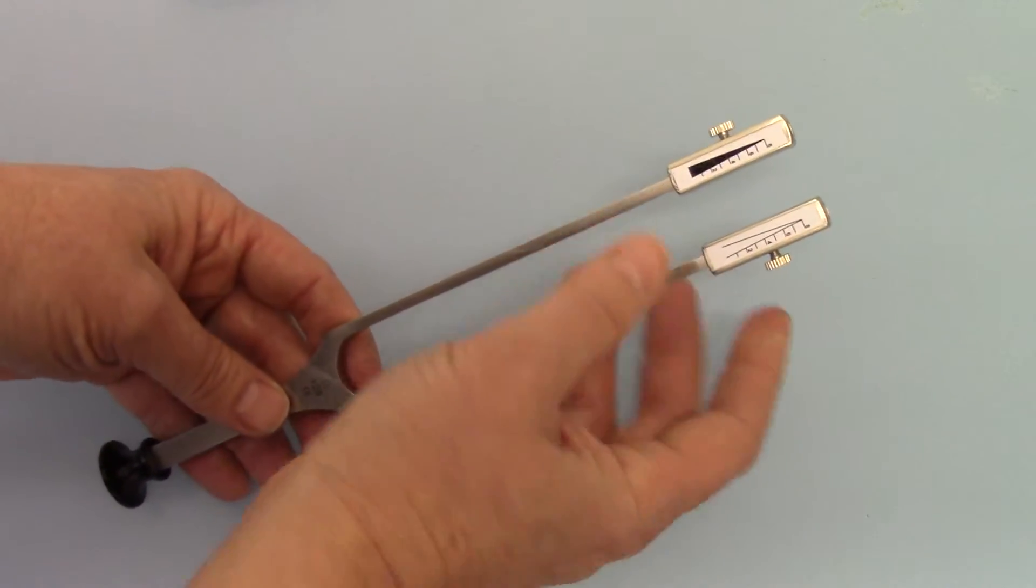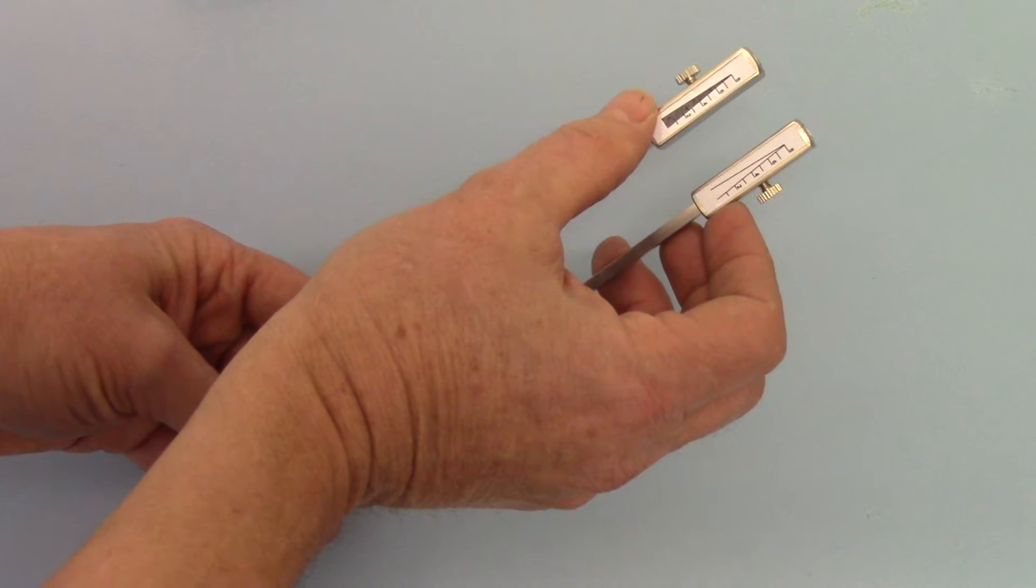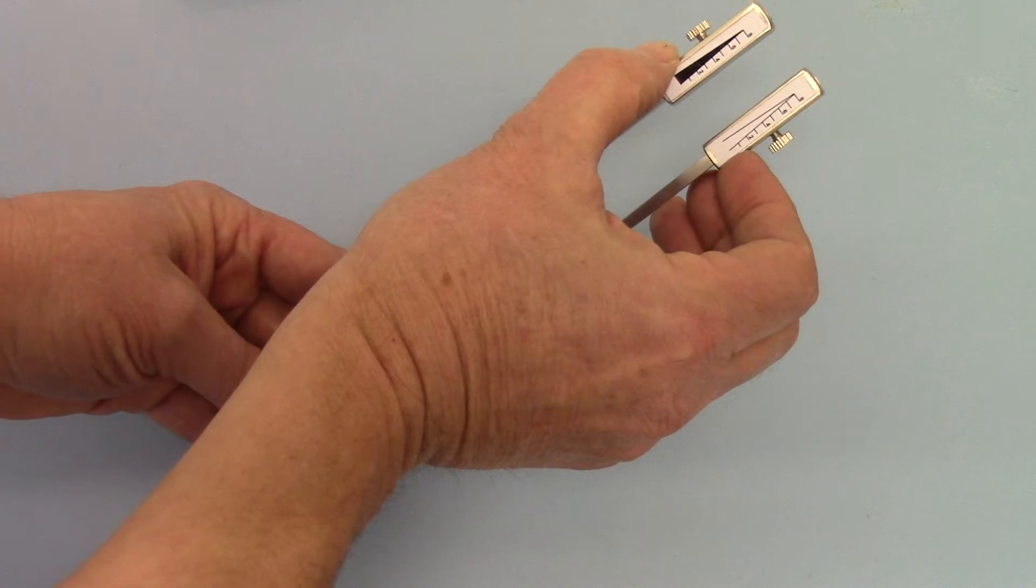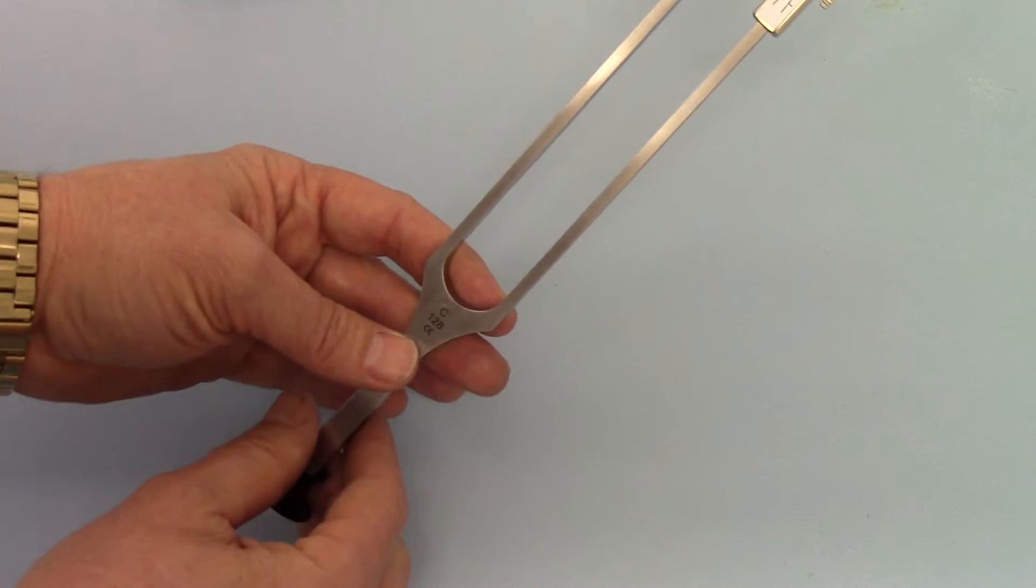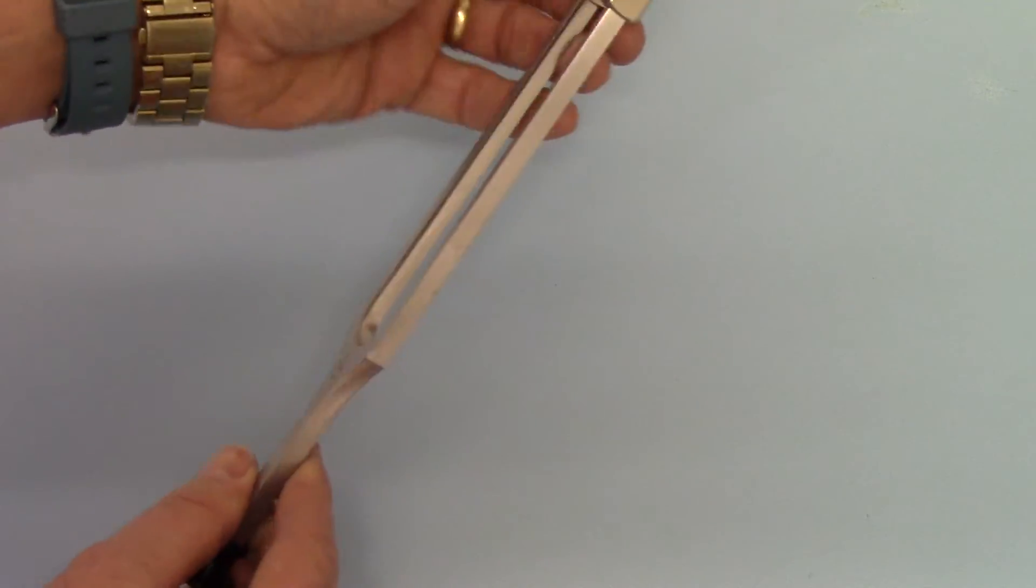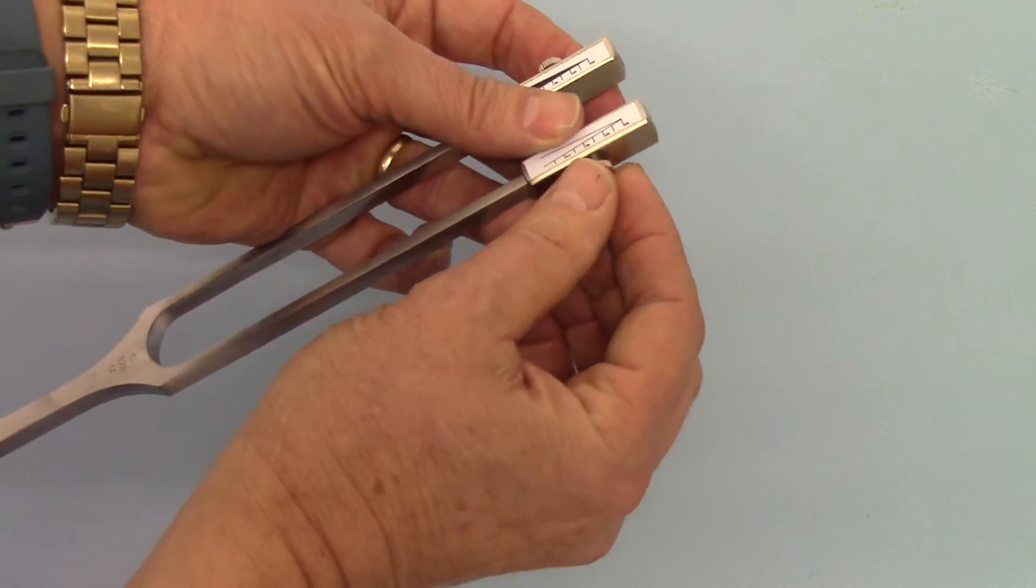And then on the tines you have the adjustments here for going from C64 up to C128 in terms of the vibration. So those are fully adjustable on these screws on the side.